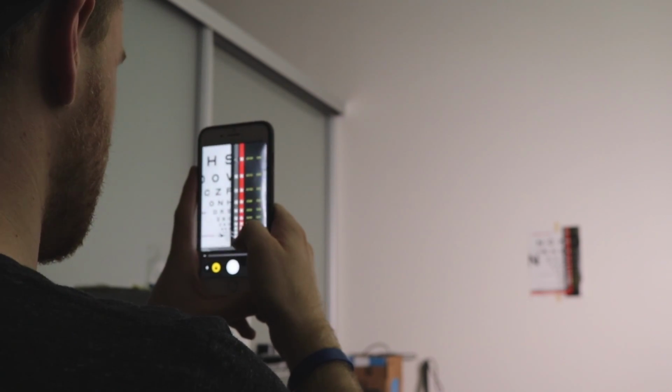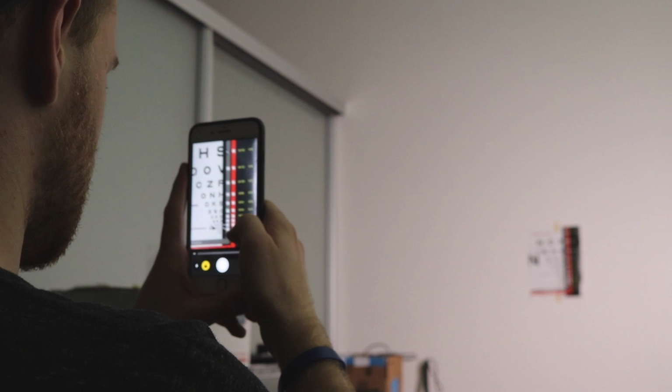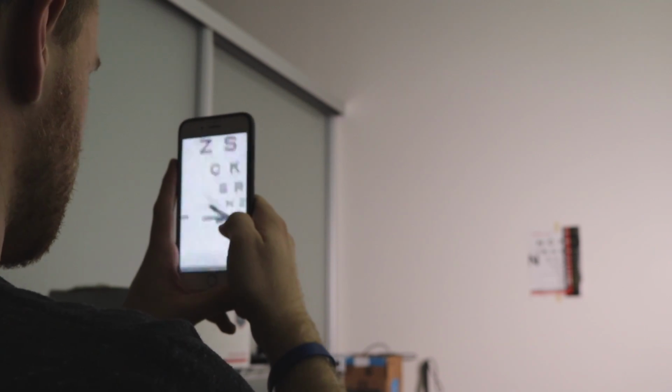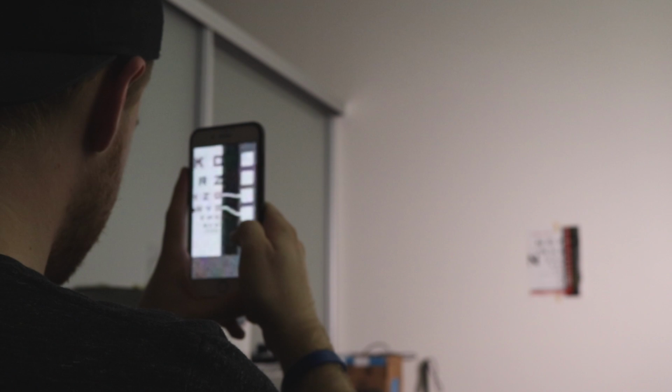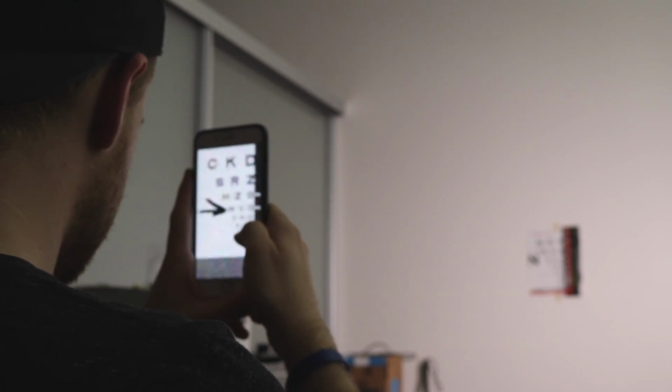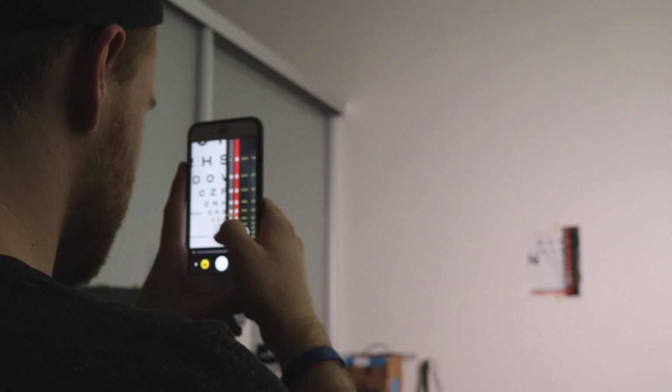Another tip I recommend is to use the zoom that's built in, just like on the Mac, but universally on iOS, and zoom in closer if you need to try and identify something. So doing this allows me to try to make out the fact that that says NVD. Something I would not have made out otherwise. And that's as far as my vision is going to see from this distance.